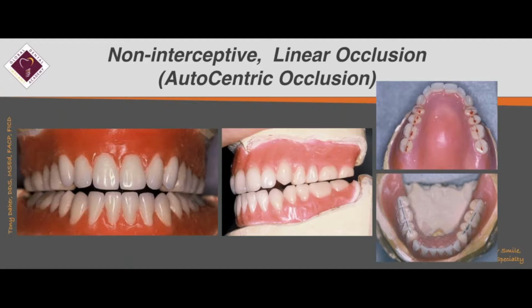So the teeth are not three-dimensional like the ones before. On the other hand, on the mandibular arch, the premolar and molar functional cusp tips are turned into a blade, very sharp. And these teeth are made of porcelain. So you have bladed teeth on the bottom against the flat occlusal surfaces on the maxillary arch.